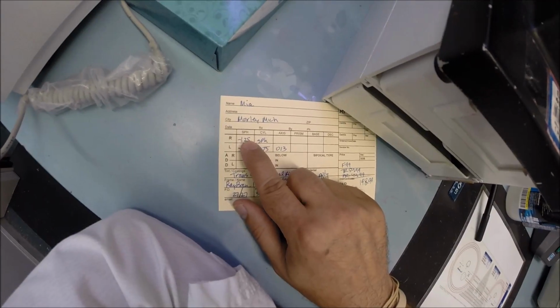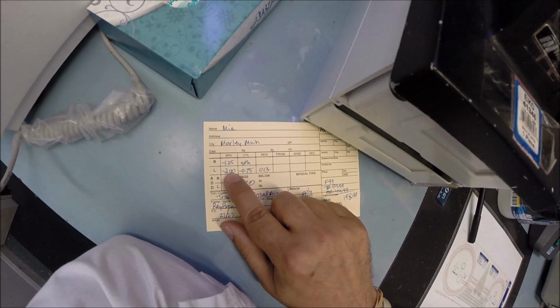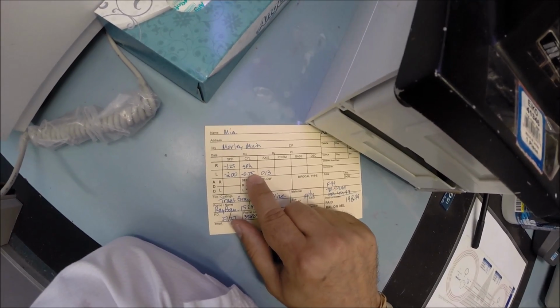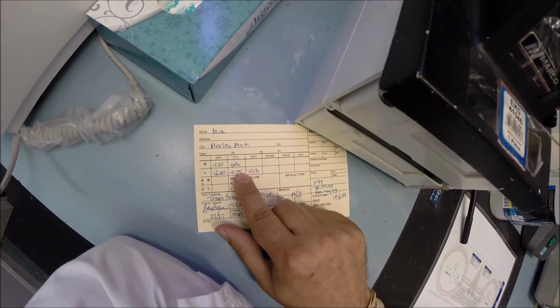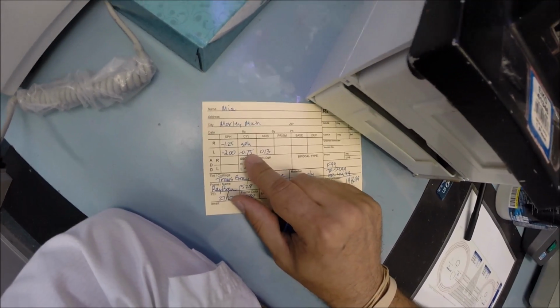So you're on your right eye, you're on the 5th rung of a ladder. The left eye, you're on the 8th rung of a ladder. And then with your astigmatism correction, you're going to climb up to the 11th rung. Now the way you can tell if you have astigmatism is close your eyes.